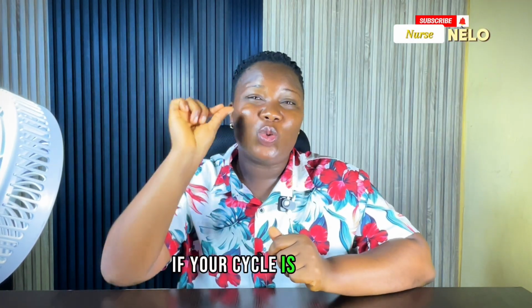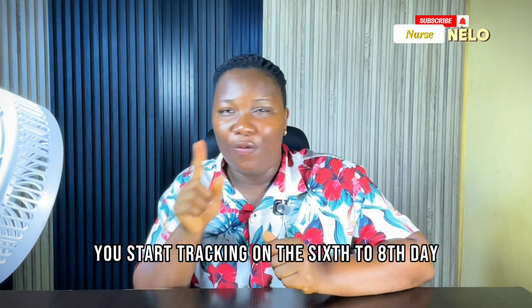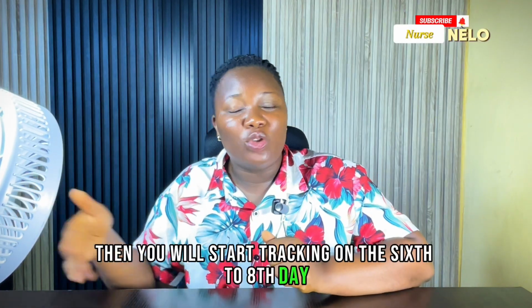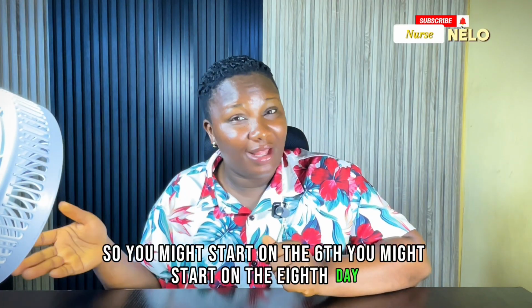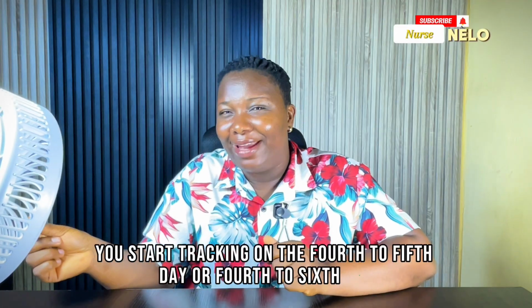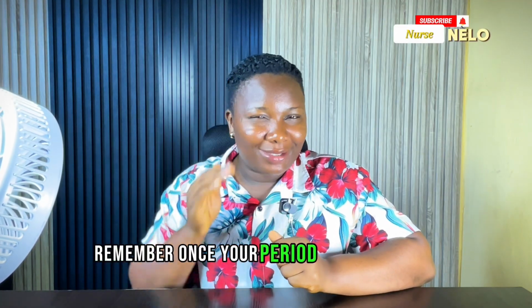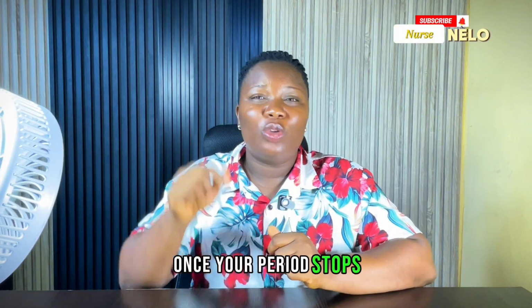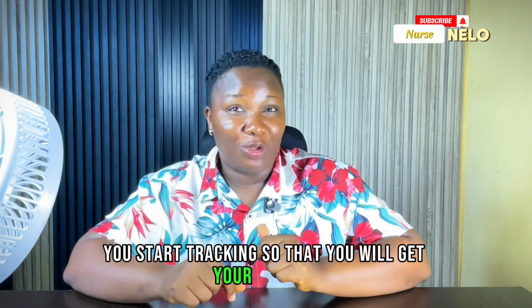If your cycle is 26 days, you start tracking on the 6th to 8th day of your cycle. Your period will stop on the 4th day, then you will start tracking on the 6th to 8th day. So you might start on the 6th, you might start on the 8th day. That's why I gave this range. If your cycle is 24 days, you start tracking on the 4th to 5th day or 4th to 6th day. Remember, once your period stops, if you have a 24 day cycle, you start tracking so that you will get your result. Do you understand?